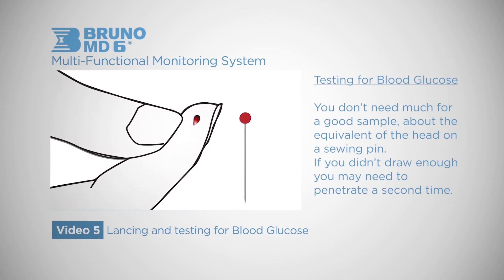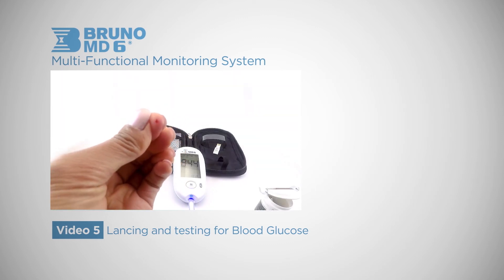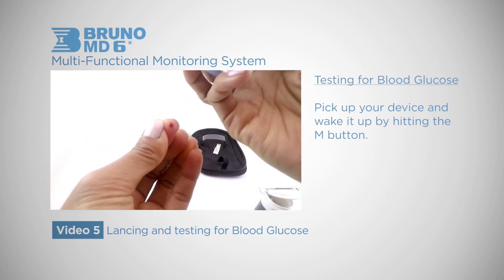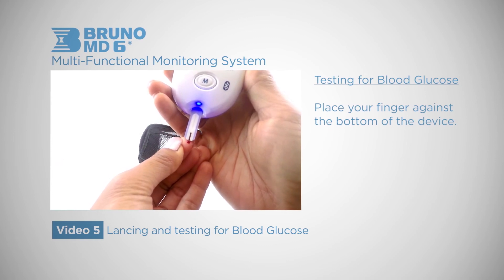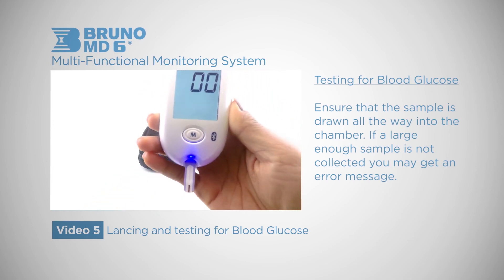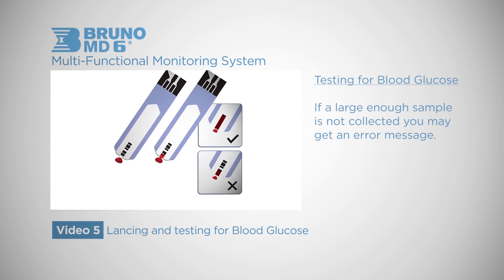You don't need much for a good sample — about the equivalent of a head on a sewing pin. If you didn't draw enough you may need to penetrate a second time. Also be careful to not smear your sample. Pick up your device and wake it up by hitting the M button. Place your finger against the bottom of the device; the device will drink up the sample. Ensure that the sample goes all the way up to the absorbent hole. If a large enough sample is not collected, you may get an error message.